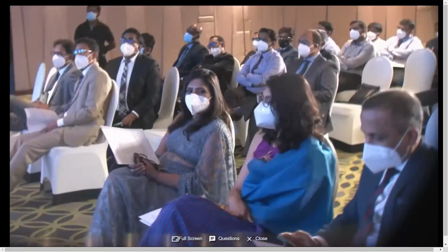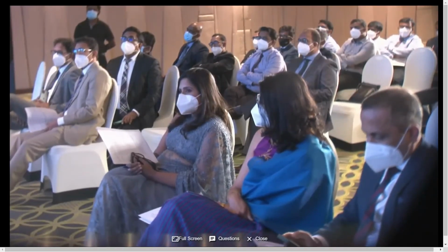So you have the carina; your crossing is proximal in a DK crush, whereas in a culotte it's a distal cross. Does it make any difference? Because sometimes we won't be able to do it when we perform this. It is very difficult.